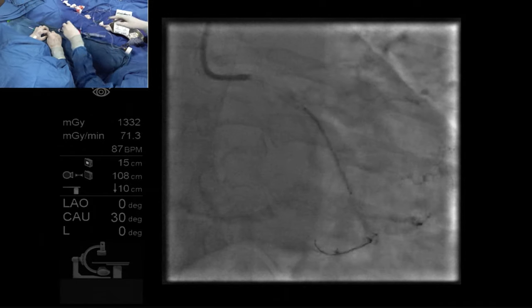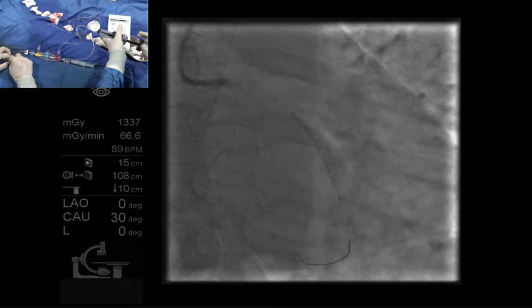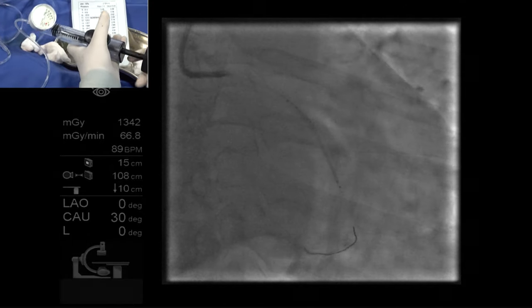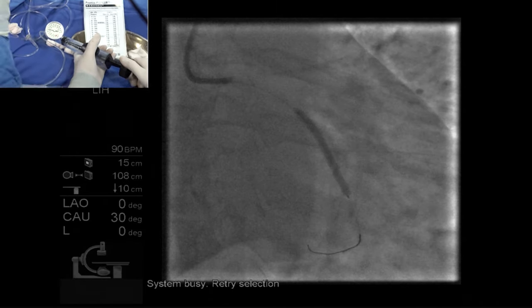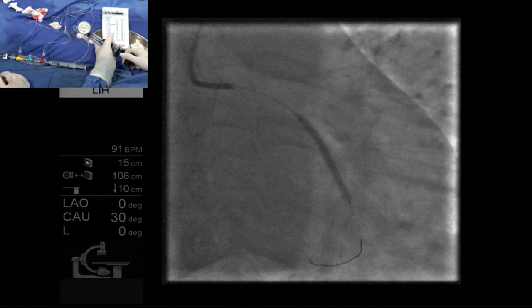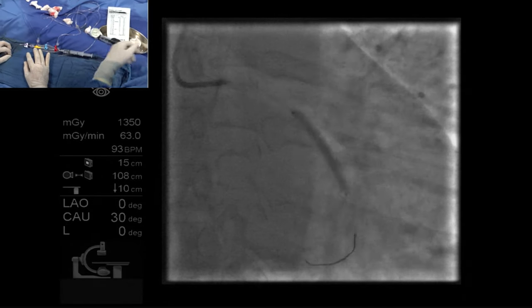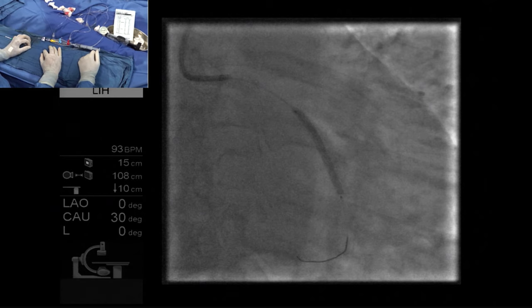Okay. Yeah, go up there. Magnification is too much. It's a first mag only. I'm just not used to it. If I go 20, that's going to be too big. How high did you deploy? 12. Leave it. How long do you stay? 12. It's 32. We're going to leave it at least for 20 to 30 seconds.